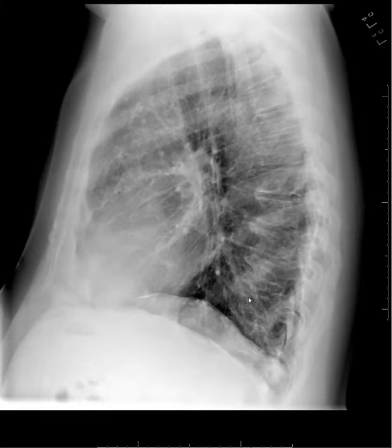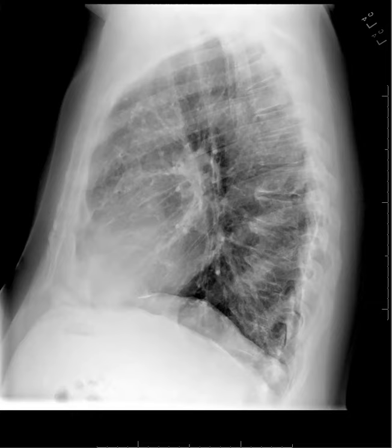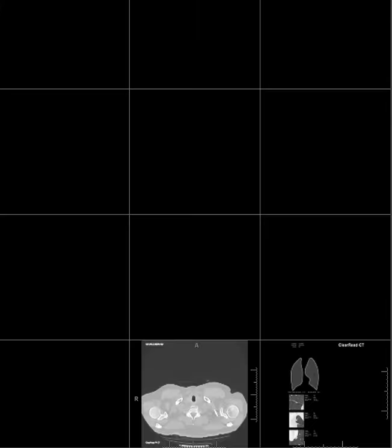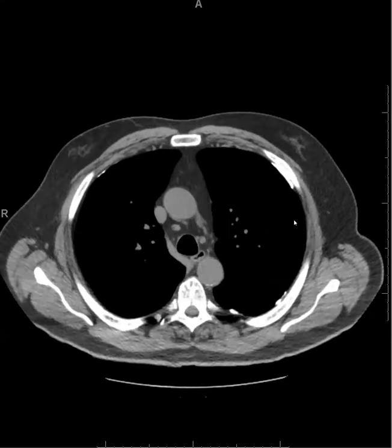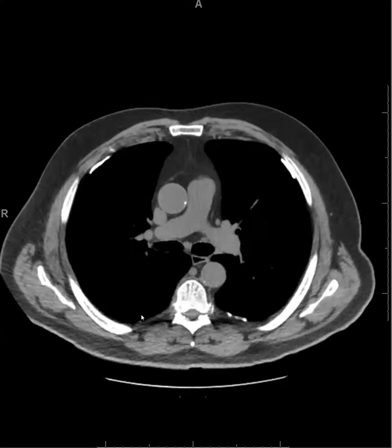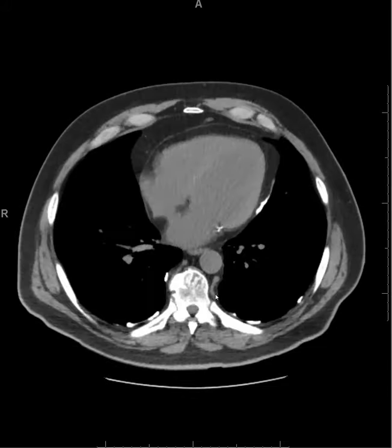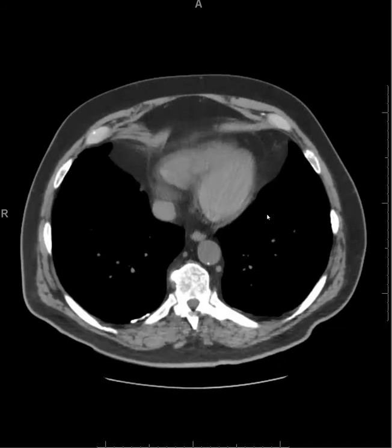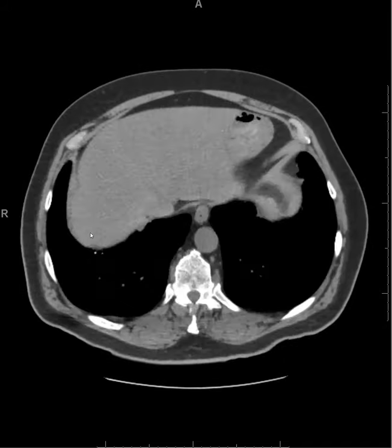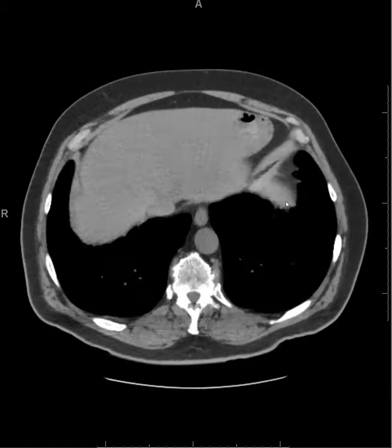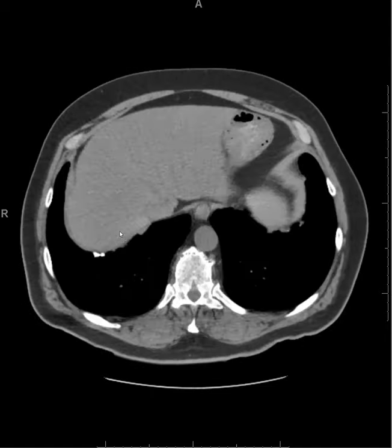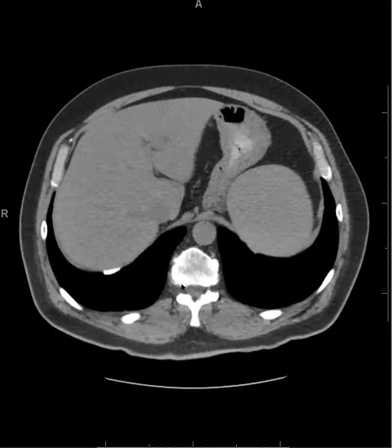This is a classic example of asbestos-related pleural disease. If we pull up the CT, we're going to see a lot of these plaques along the anterolateral and posterolateral thorax — a pretty classic location. Also paravertebral, which is pretty common. Not uncommon to see some along the diaphragm, as we see here on the left and on the right. It's a pretty classic distribution.